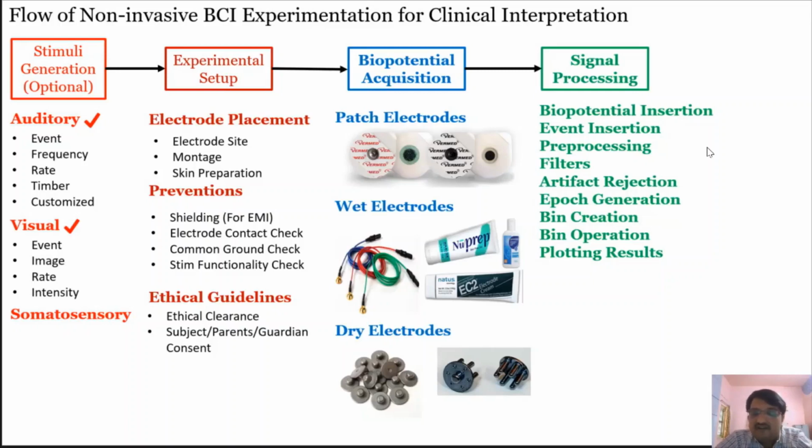Another type of artifact is generated by the interference environment. As I mentioned, electromagnetic interference. It is highly possible that if you are not using shielded wire, or your wires are too near each other without shielding, then there will be some interference or crosstalk between the wires. All of this results in unwanted signals in your EEG, and it will be removed by pre-processing algorithms.